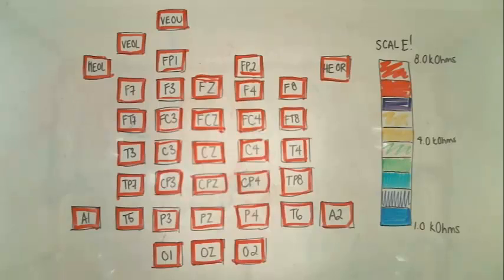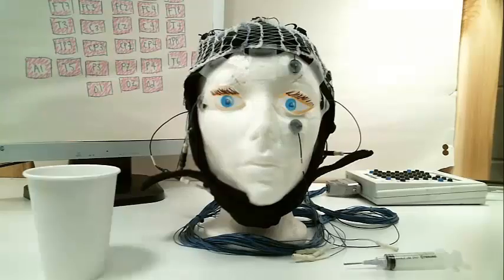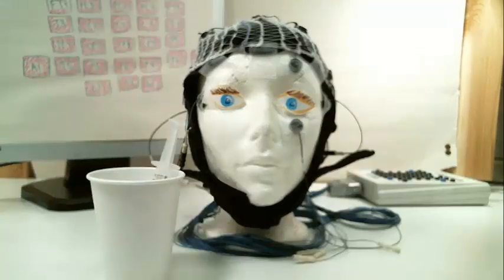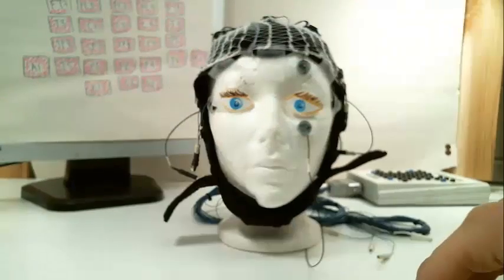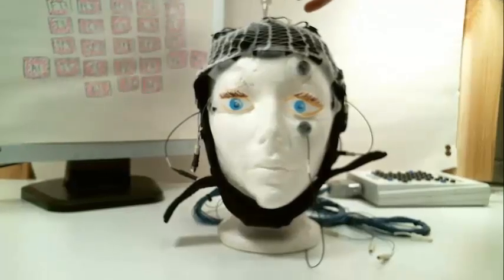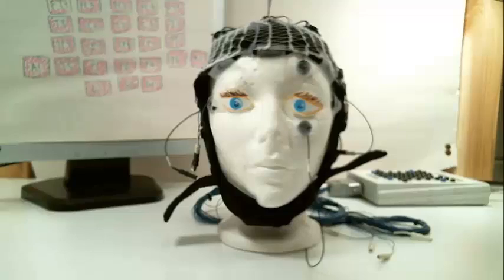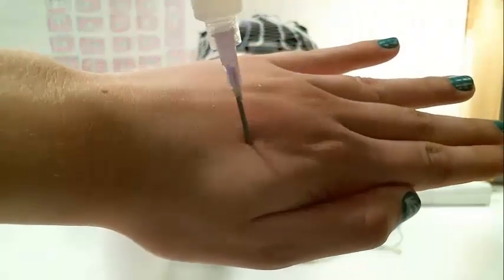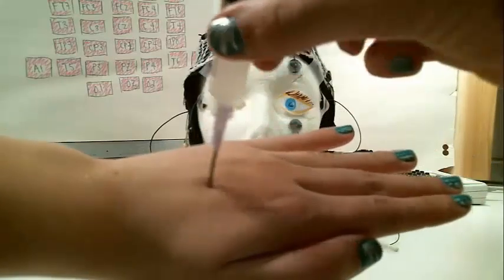Ideally, we would like the impedances to be dark blue, which represents the lowest impedance. The procedure to prepare the cap electrodes is similar to other electrode prep, but we use different tools. A blunt needle filled with conductive gel is our tool. The needle end fits the holes of the electrodes. The needle is inserted into the electrode and rested against the scalp, then moved gently over the scalp in small circles to move the hair out of the way and to slightly abrade the skin. It is important that the end of the needle is actually moving across the scalp, because if the tip is sitting in the same spot, it will not properly prepare the skin and, more importantly, it will likely hurt the participant.